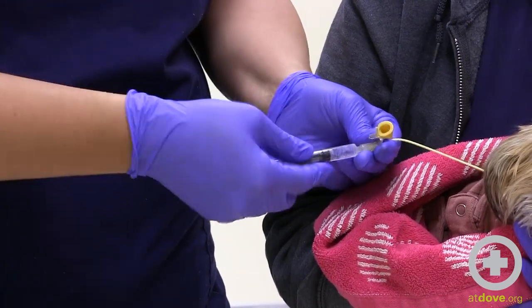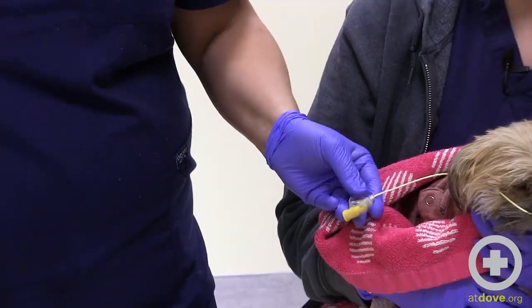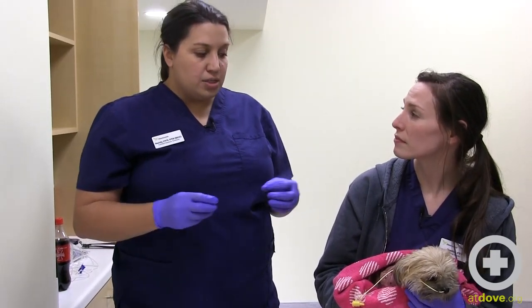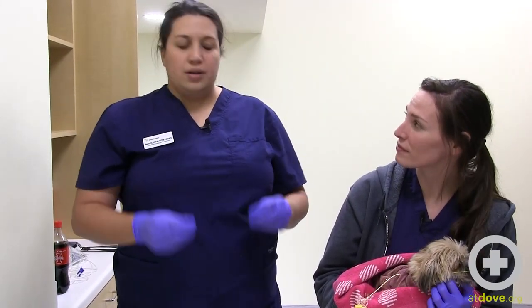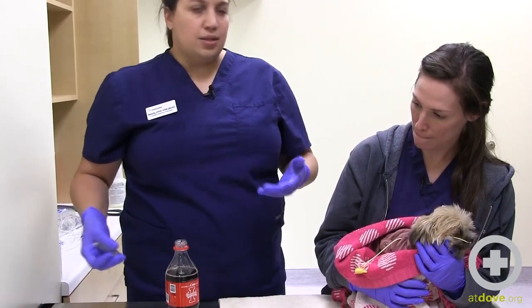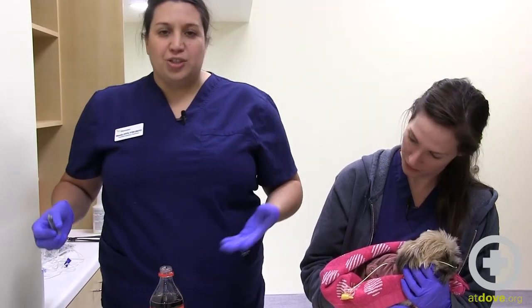We can move on to our next option. For really challenging clogs in feeding tubes, I use a carbonated soda — I go upstairs to our break room and get a Coca-Cola. Sometimes just the extra effect of carbonated bubbles can be really helpful in breaking up the clog, whether it's mucus or medications. I'm going to drop a small amount in — this has sugar and other things she doesn't really need, and too much carbonation would probably be irritating.